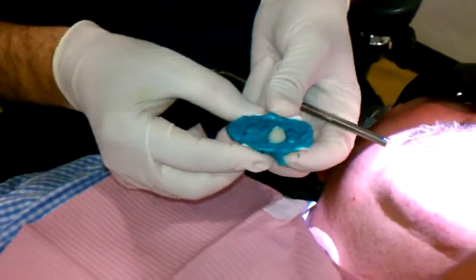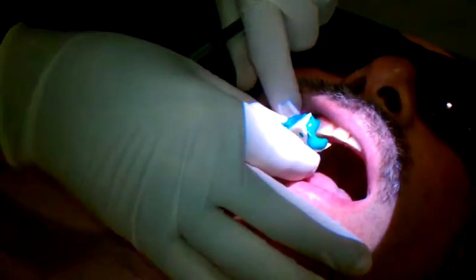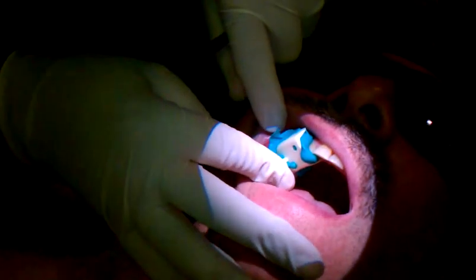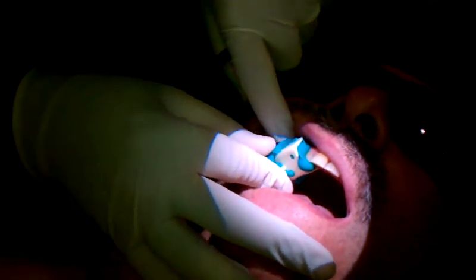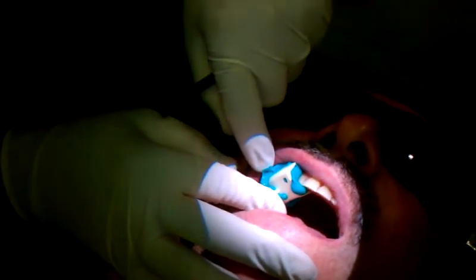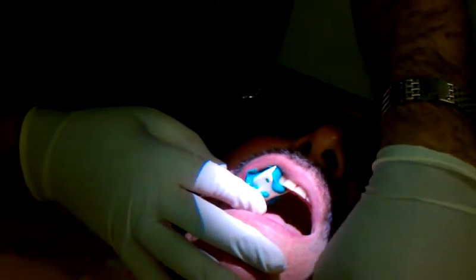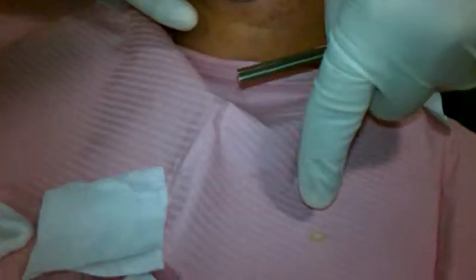As you can see, it's a little overflowed, not too much. I'm going to go ahead and just put the impression material back in the mouth. And we're going to extrude some just to make sure that it is ready. I will just check it here.